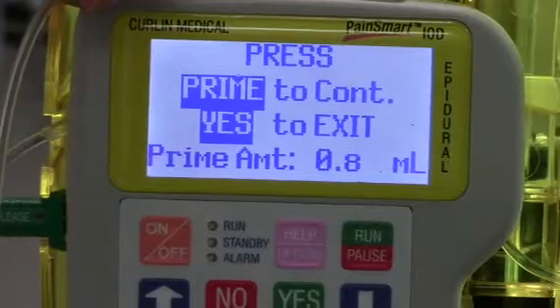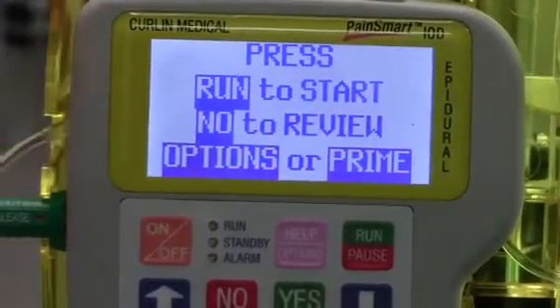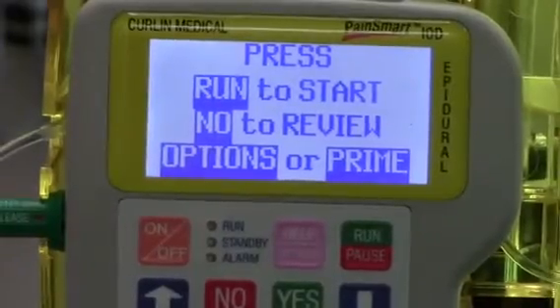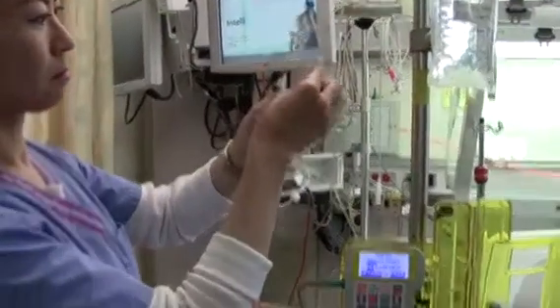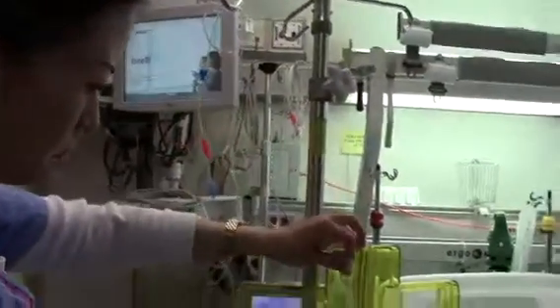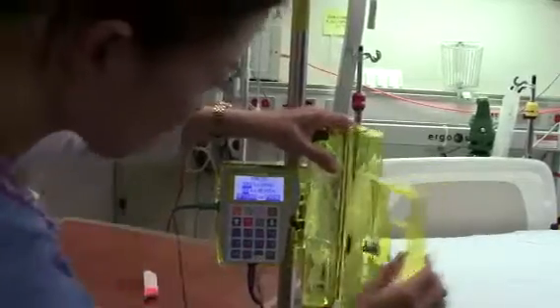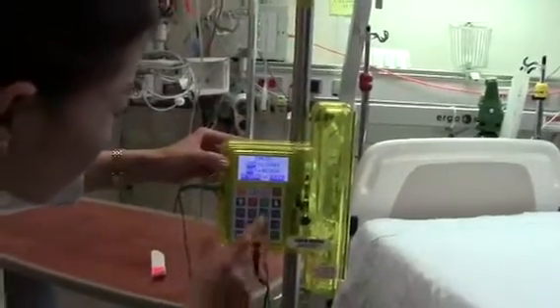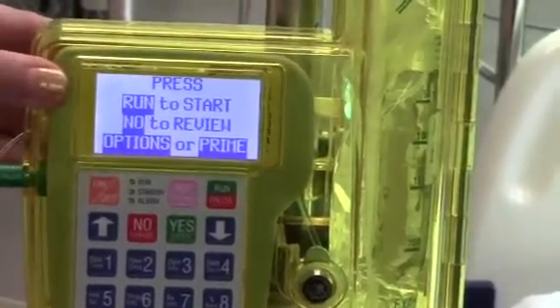Once we have completely primed, the next step is to go ahead and label with a red tag that this is an epidural catheter. This is to ensure that nothing else except the epidural medication infuses. We're now ready to connect to the patient. You would lock the lockbox and connect the IV tubing to your patient, and then press run.